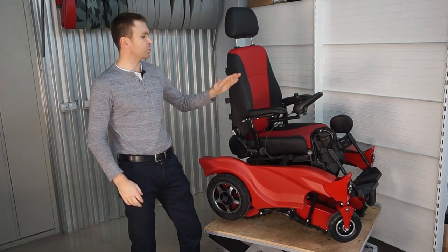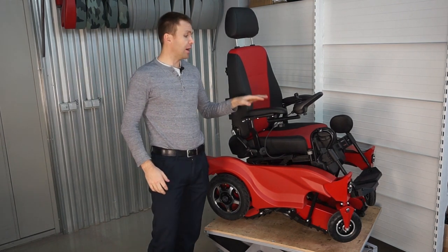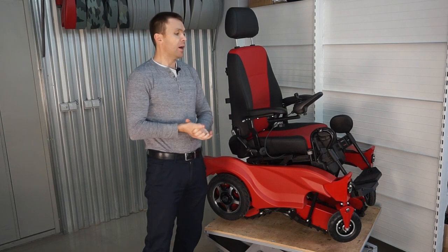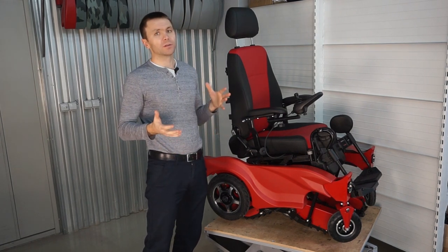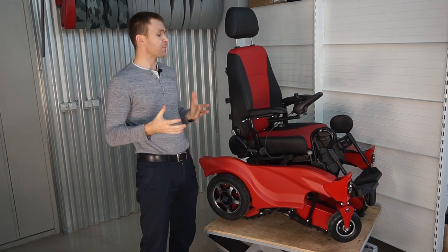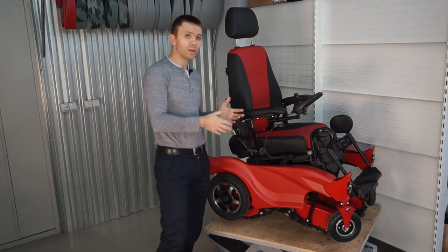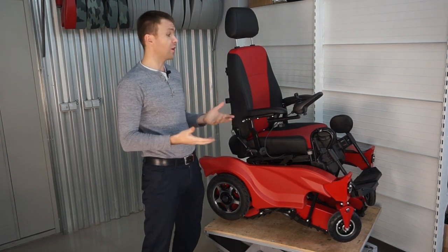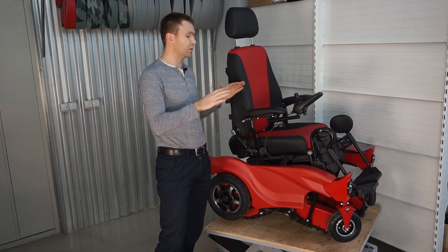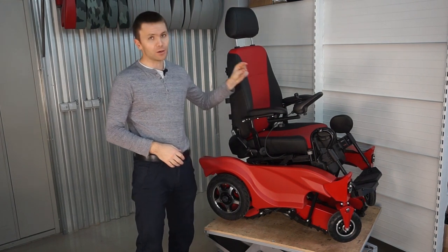Hi, my name is Ivan and today I'm going to make a video review of the stairs climbing wheelchair GTS 5. I will compare this model to the previous model GTS 3. We decided to get rid of the GTS 4 model because it was very similar visually to the GTS 3 and very similar technically to the GTS 5, so not to create confusion we will compare GTS 5 to GTS 3.